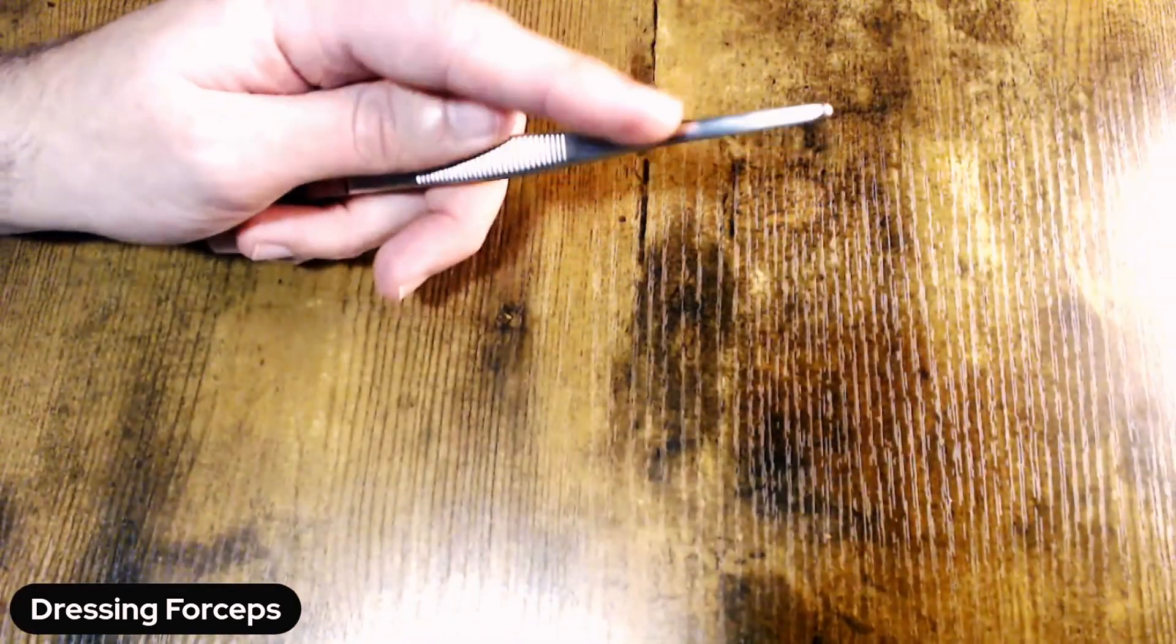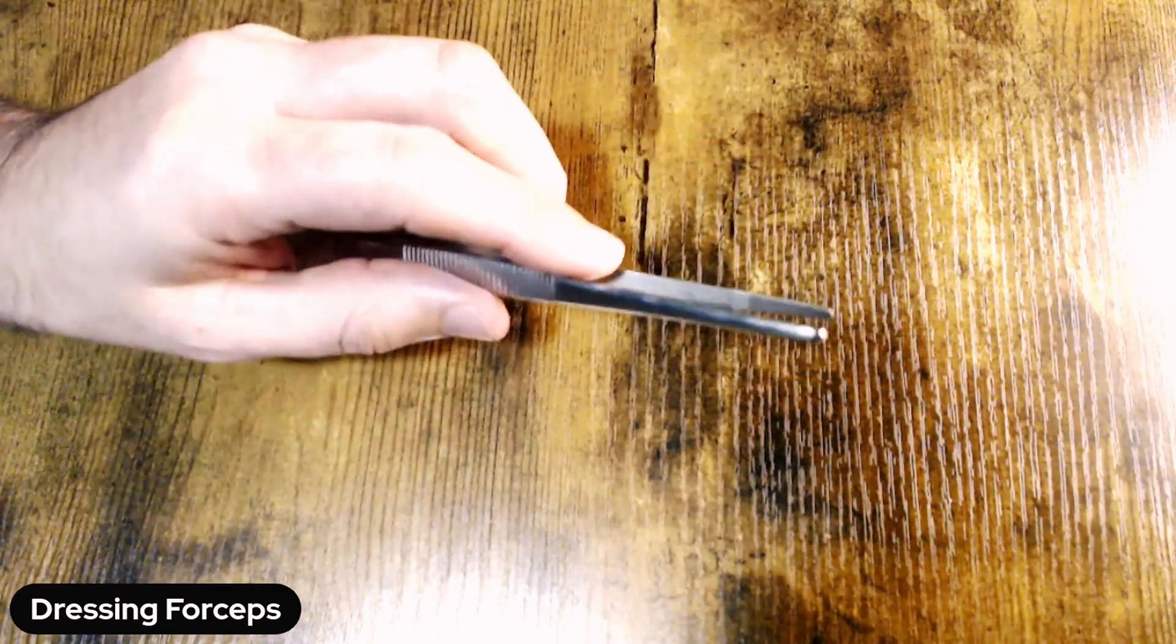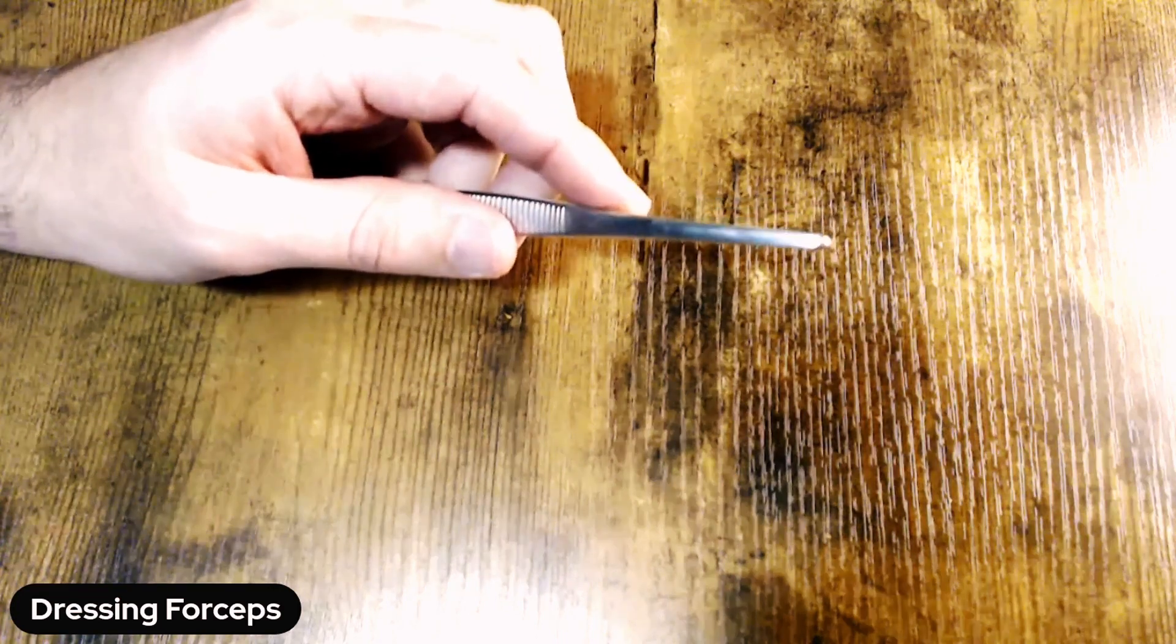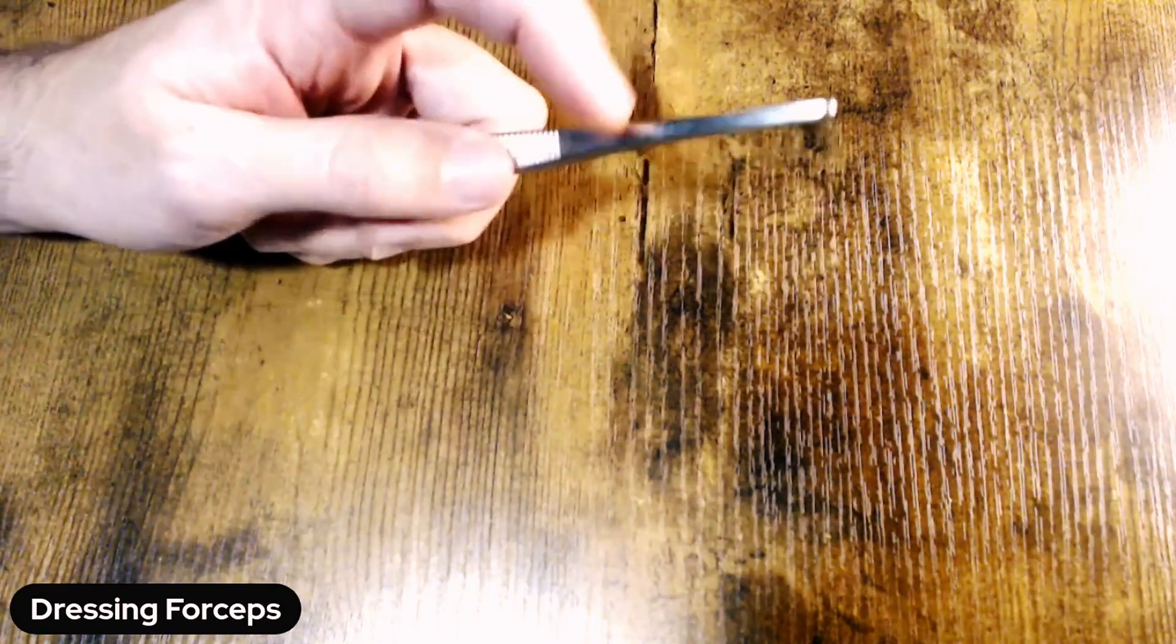Okay, so make sure you get the jaws aligned. If you have a forcep with teeth, we'll talk about that in another episode, but you don't want to hear any clicking or rubbing of teeth. But obviously because this is a dressing forcep, you have no teeth to worry about.